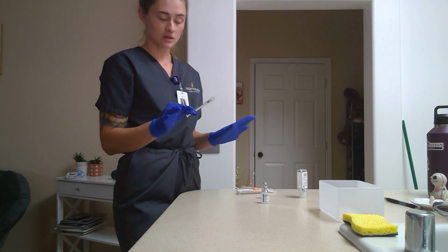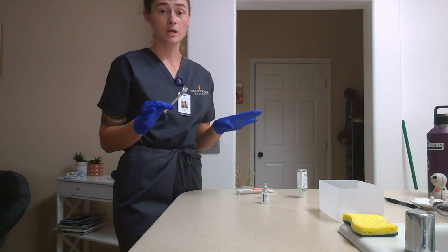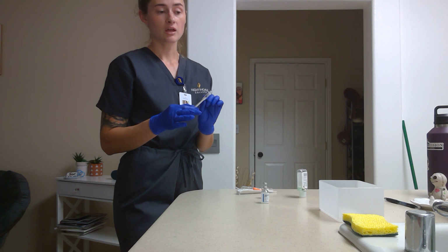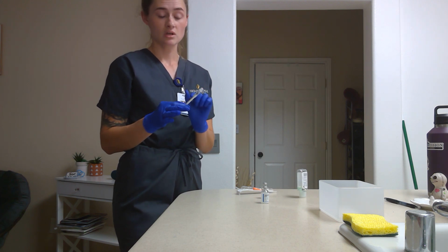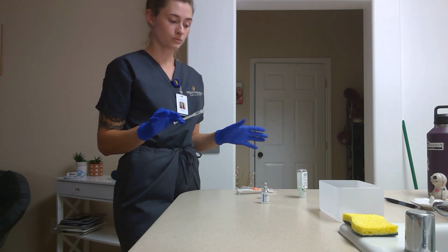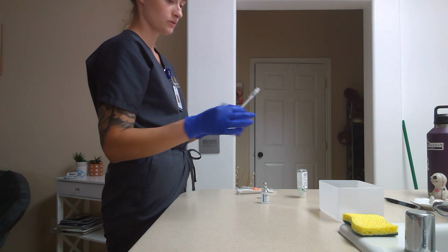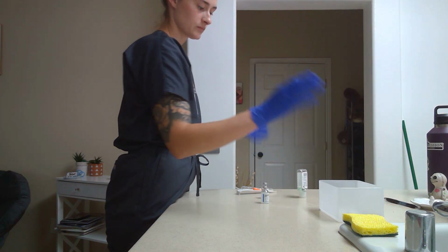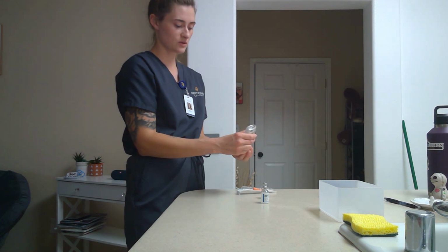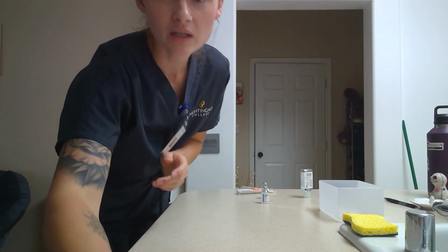Now that I have this done, if for some reason the medication is not at bedside, it's important to make sure you put the patient's name and the amount of units or the dose on to the syringe here. So that way we know what we're giving if we're giving it later. After that's been done, I'm going to put that there. Remove my gloves, do hand hygiene. And that completes the video.